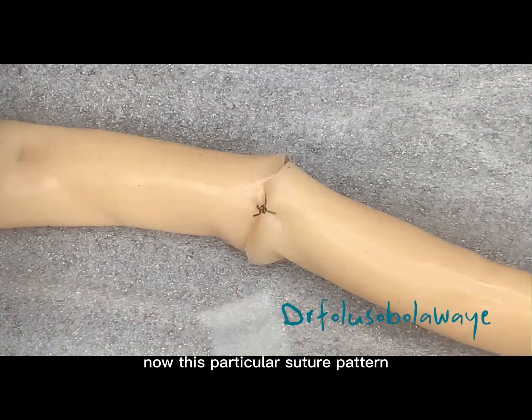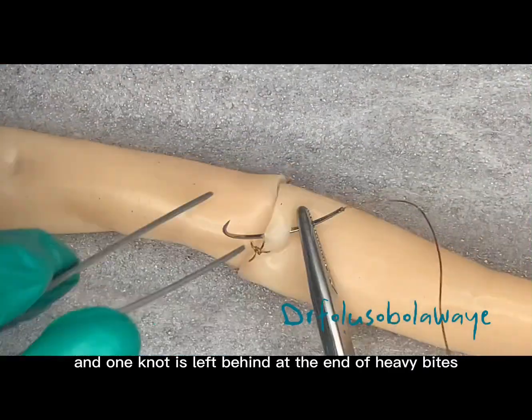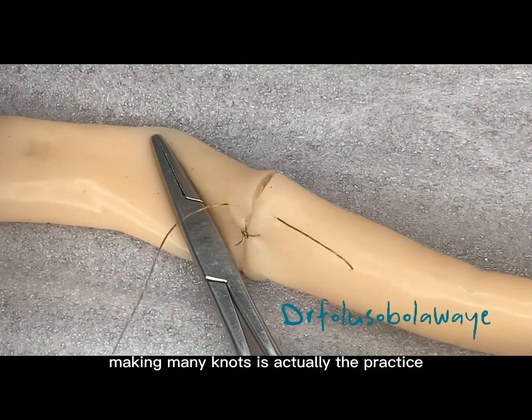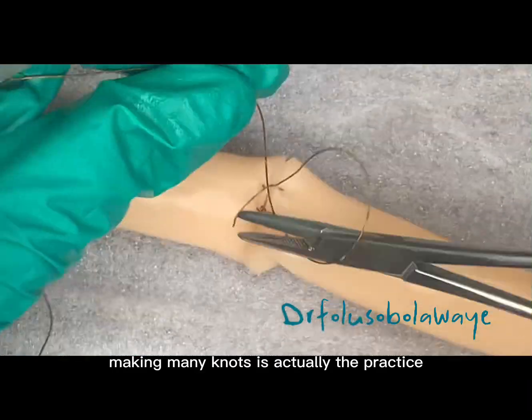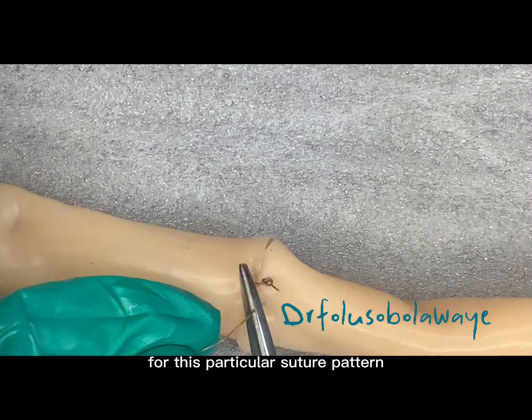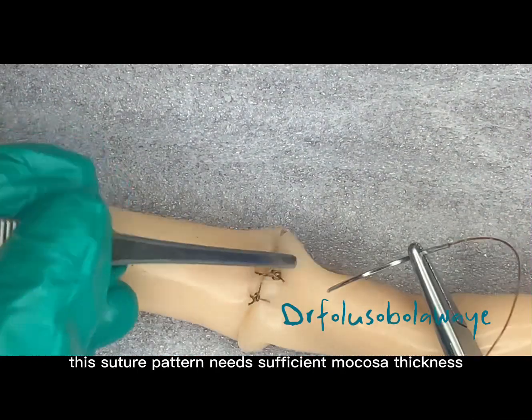This particular suture pattern is an interrupted suture pattern, and one knot is left behind at the end of each bite. Making many knots is actually the practice for this particular suture pattern.